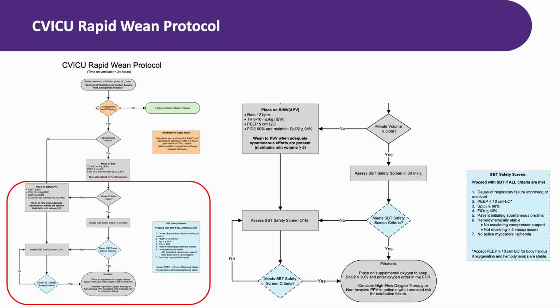If the patient meets the criteria, you extubate, and if they don't meet the criteria, you don't. There is no gray area. The criteria are your guardrails. Make sure you document the extubation, the time, patient response, and your post-extubation plan. Have all of your post-extubation supplies ready, including a supplemental oxygen delivery device and suction, and be prepared to support the patient if they have difficulty immediately after extubation.